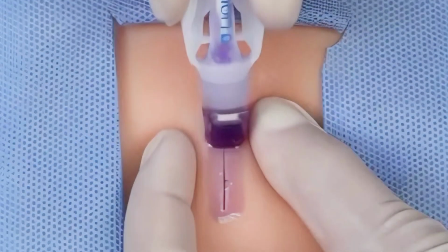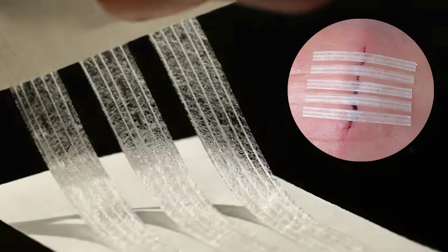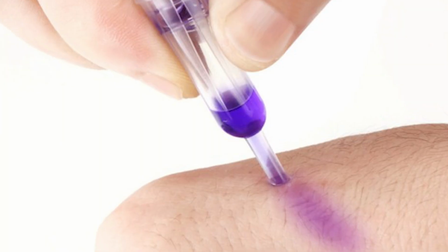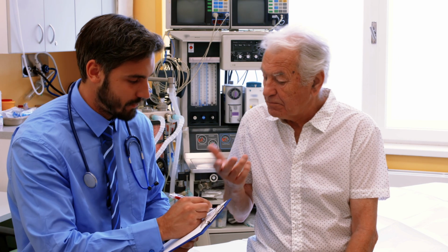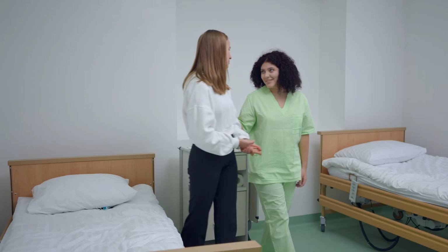We usually use a surgical glue, also called a liquid band-aid, in the incision. Sometimes we can use Steri-strips. It's very important that you tell us if you're allergic to the glue or to the Steri-strip so we know what the right thing to do for you is. Again, the minute we are done with the procedure, you can get dressed and drive home. You should be able to do your normal activities throughout the day, and you'll be able to take a shower that same day of the procedure.